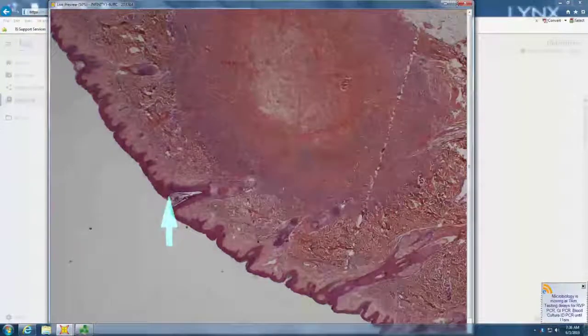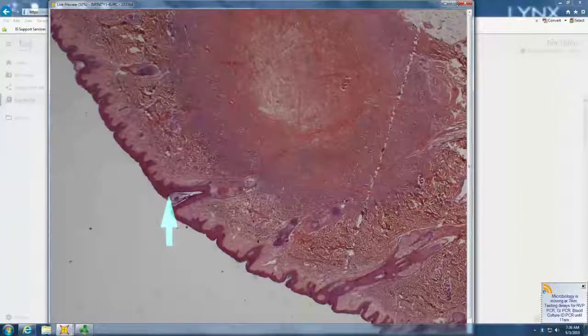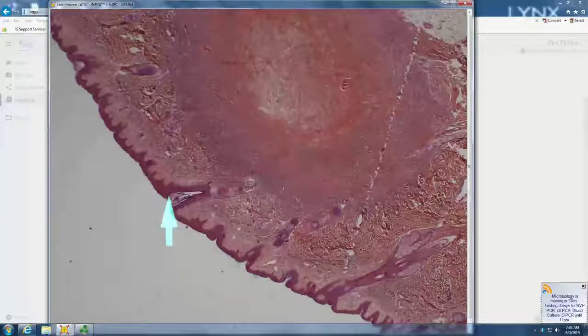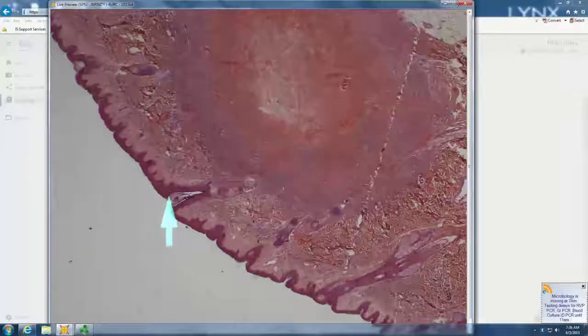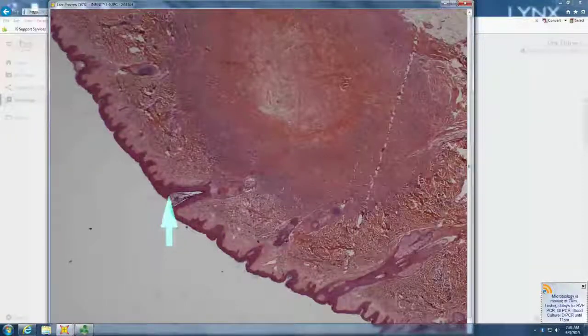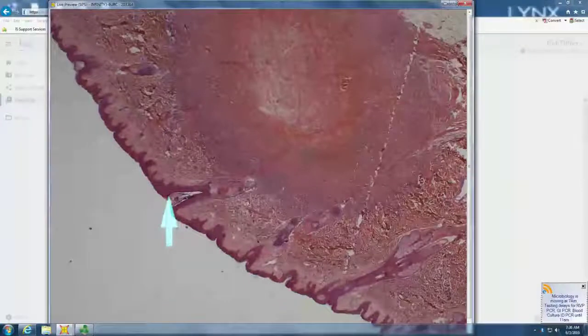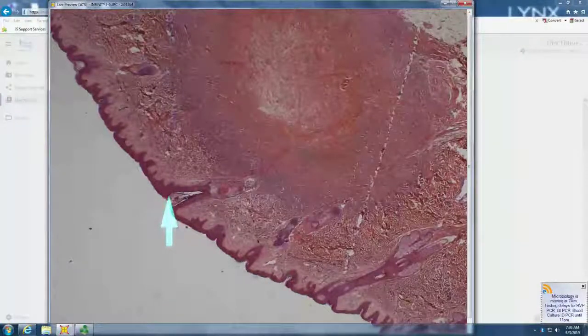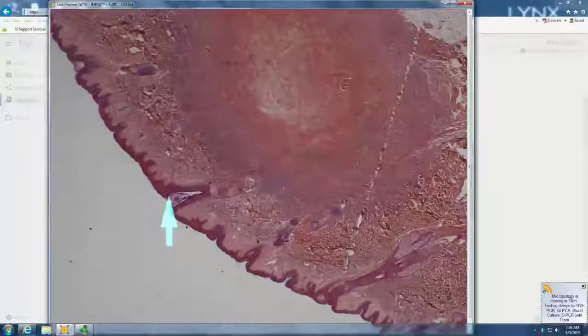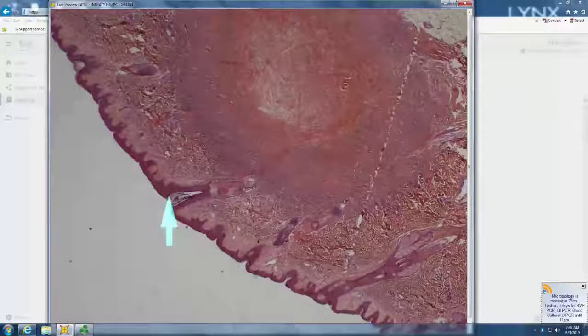So you have pleomorphic sarcomas that have, this may shock you, pleomorphism of nuclei, but are not uniformly hypercellular. You have translocation sarcomas that are uniformly hypercellular across the field, and then you have benign fibrous tumors that often have hypo and hypercellular zones.